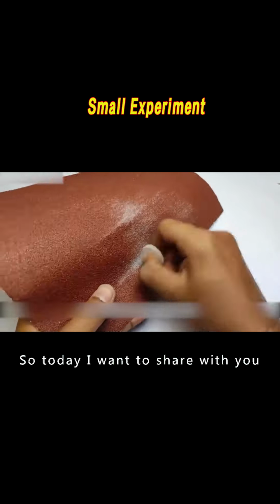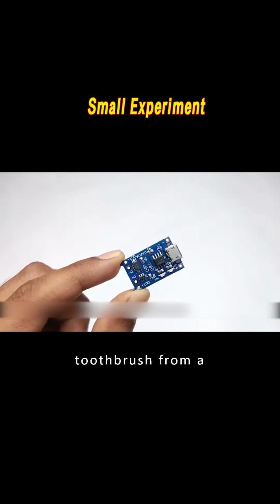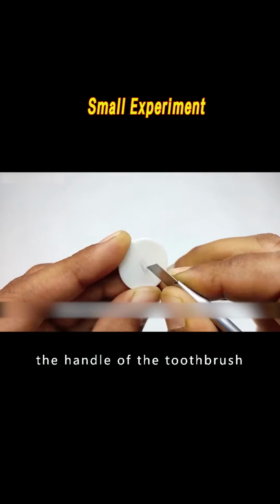So today, I want to share with you how to make an electric toothbrush, made from a few simple ingredients. First, use a PVC pipe to make the handle of the toothbrush.